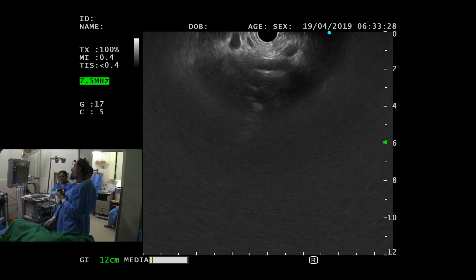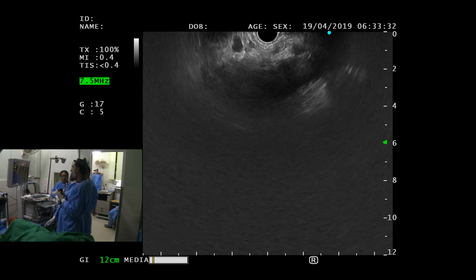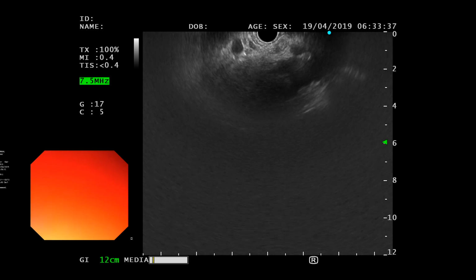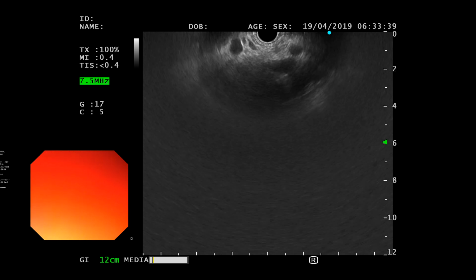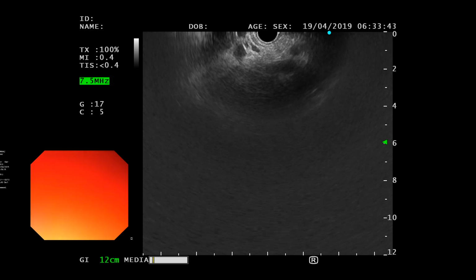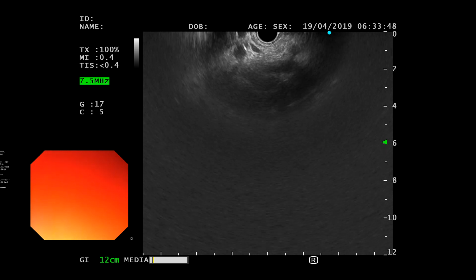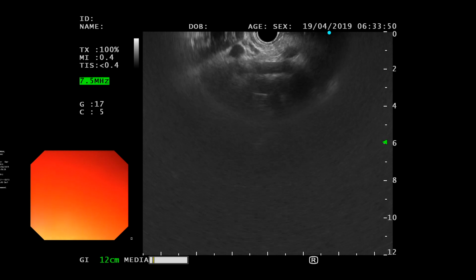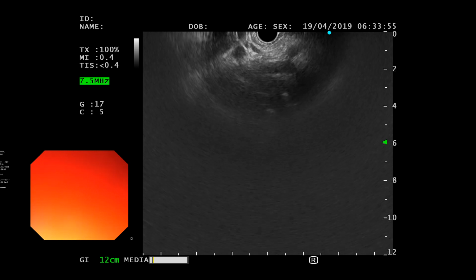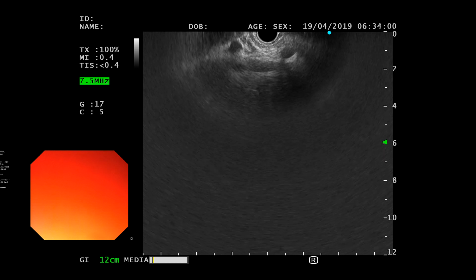Let's suppose that you're talking about the pancreas. Now, what kind of abnormalities can be there? It can be in the form of an inflammation, meaning a diffuse hypoechoic area, or it may be in the form of diffuse infiltration of an abnormal tissue like lymphomatous tissue, where it is going to be a bulky pancreas. In acute inflammation, there's going to be an increase in the bulk. In lymphoma, it's going to be an increase in the bulk. So these are the two situations where you can have an increase in the bulk.